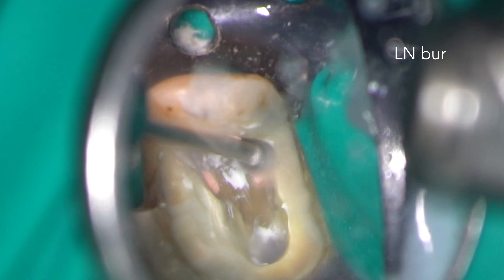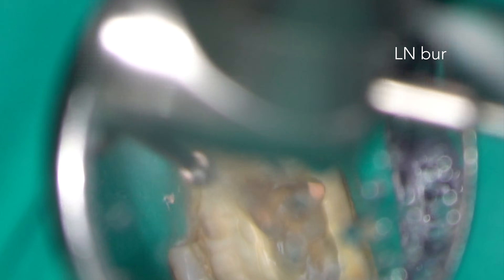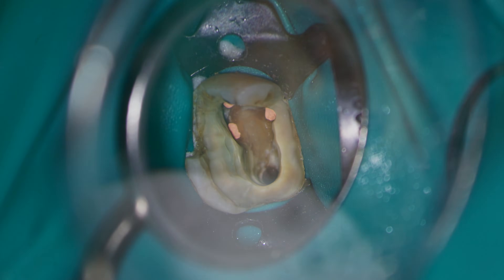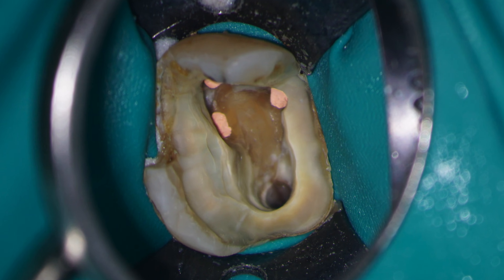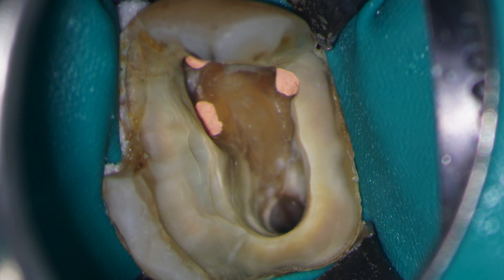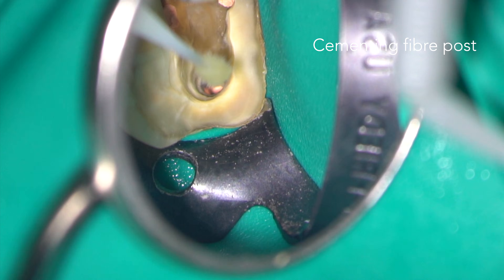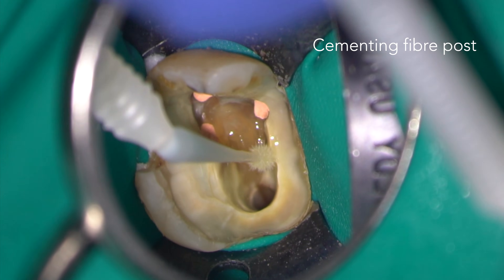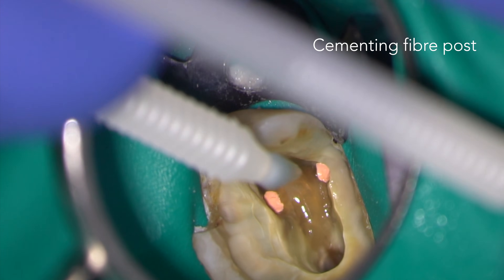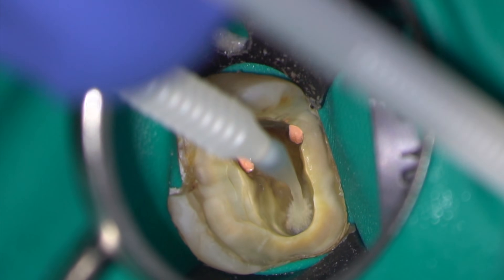I'm using an LN burr with water spray to clean up the orifices of the obturated root canals, ready for restoration — in this case with a fibre post and dual cure composite. As part of the restorative sequence, I'm using a fibre post in the palatal canal and dual cure composite to build up a core, ready for the general practitioner to place a full coverage crown.